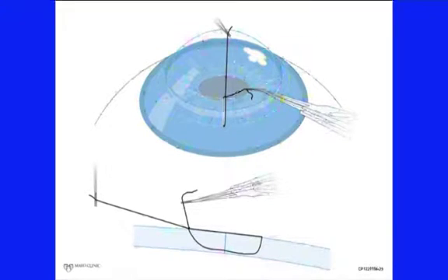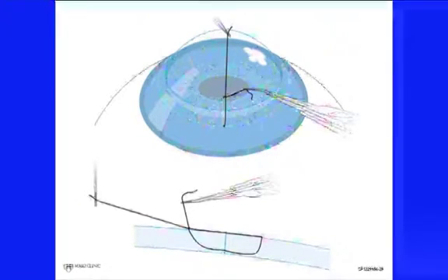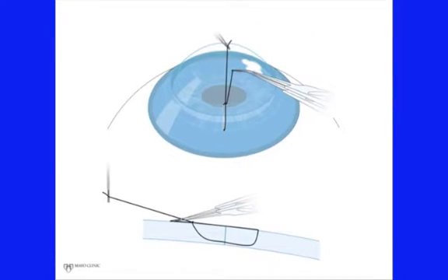Put mild tension on the short suture and move the short suture toward the graft parallel to the long suture. Then pull hard on both the long and the short suture to lock the first throw into place so it cannot tighten or loosen. Then lay the short suture on the corneal surface.